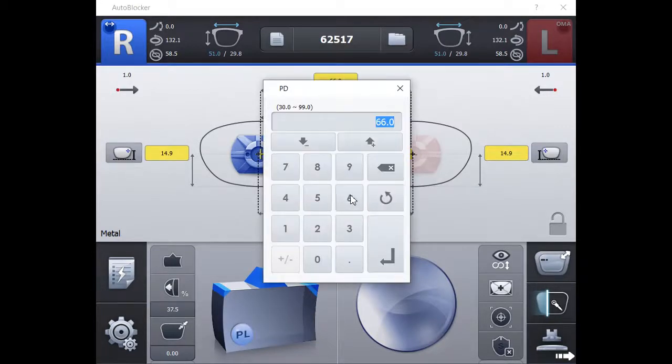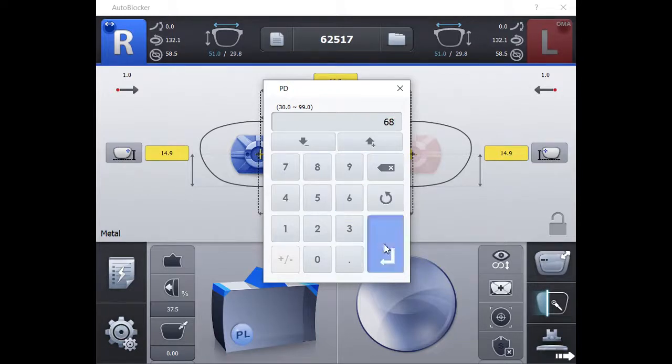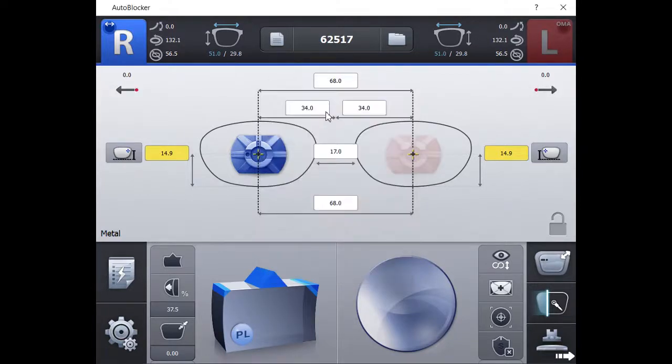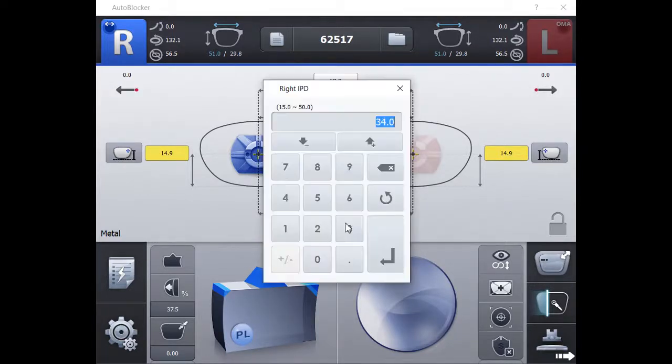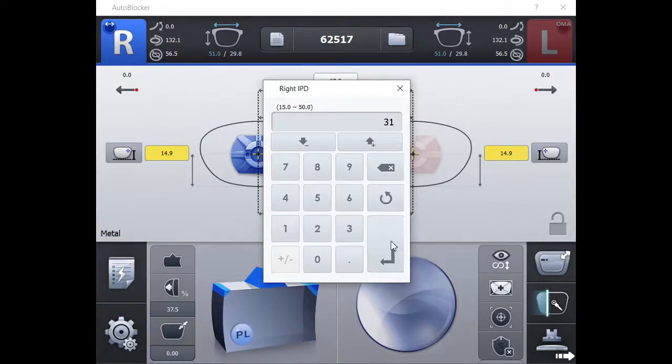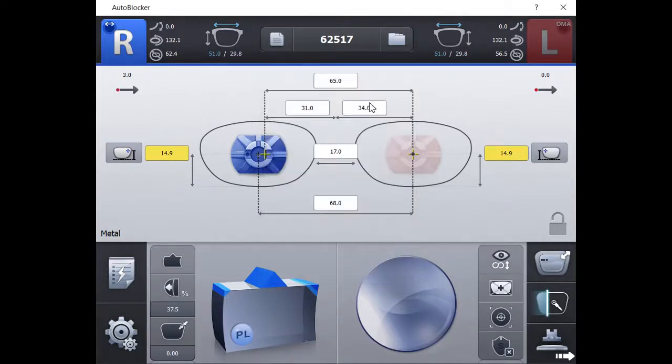You have the ability to change all numbers highlighted in yellow. The patient's PD measurement can be entered binocularly or monocularly.